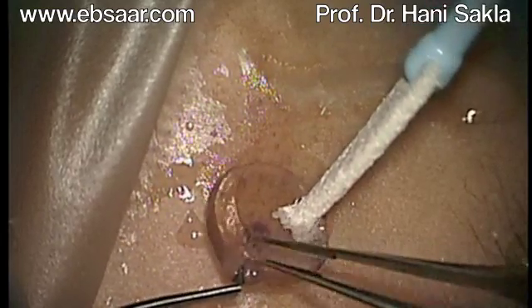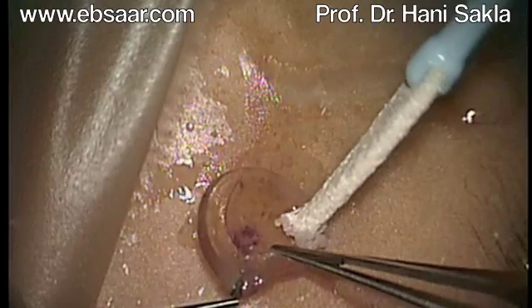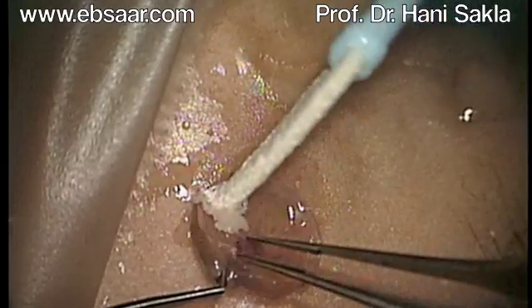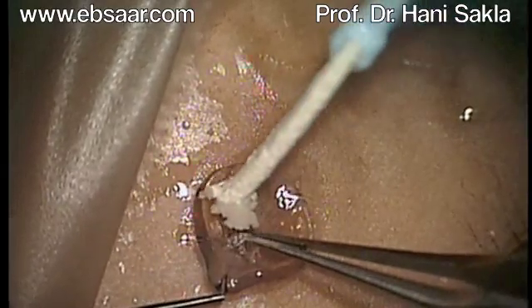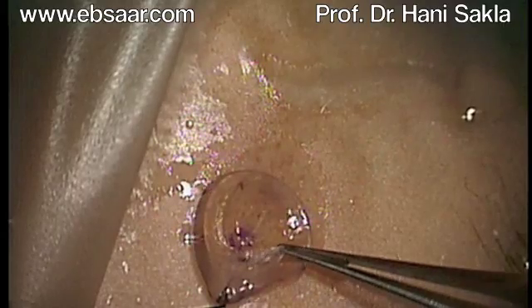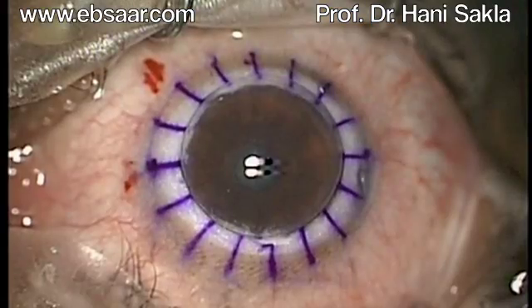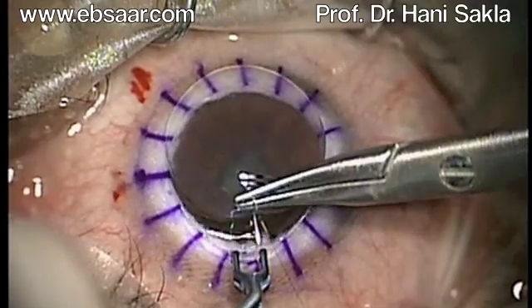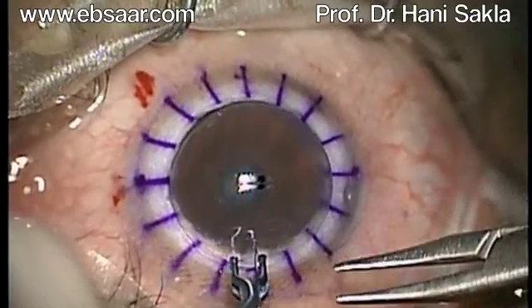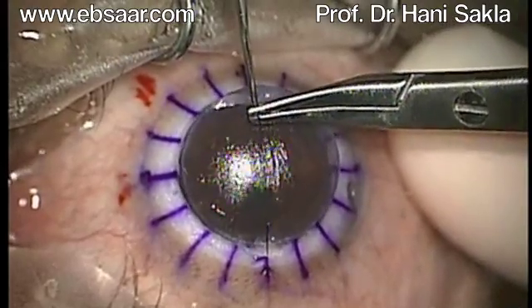Separation is usually easy. We then place the graft on the surface of the cornea and suture it with 16 interrupted sutures, though this depends on each surgeon's preferred technique.